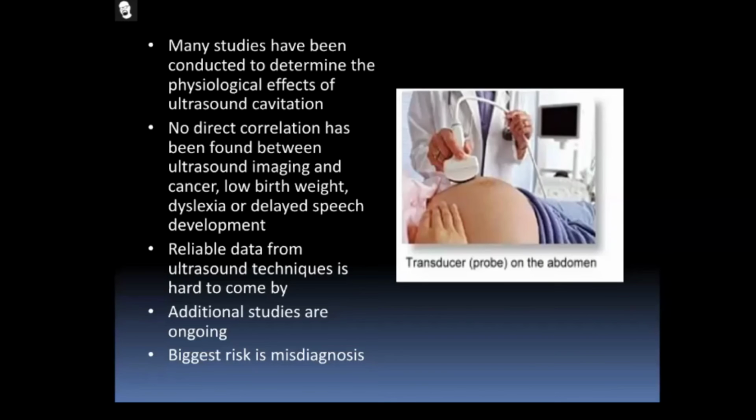Some research is also going on nowadays using sound waves, so that we can cut down at least a benign tumor. Many studies have been conducted to determine the physiological effects of ultrasound cavitation, that is, increasing temperature. No direct correlation has been found between ultrasound imaging and cancer. That is what I am mentioning about.